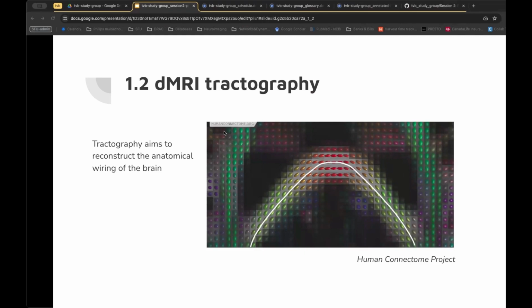I believe this is a zoomed in picture of an axial slice of a diffusion image. And what you can see here, every one of these voxels along, this is probably a commissural fiber of some sort, I'm just guessing. And then every single one of these voxels has a rendering of a probability distribution. This is the likely direction that the fibers are oriented in each of these voxels.